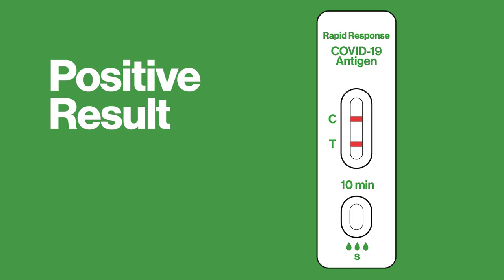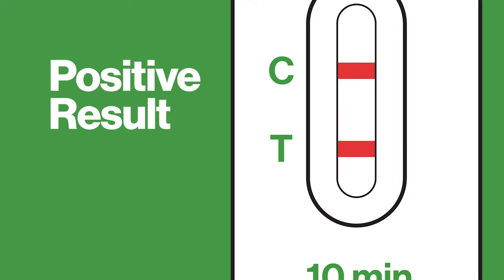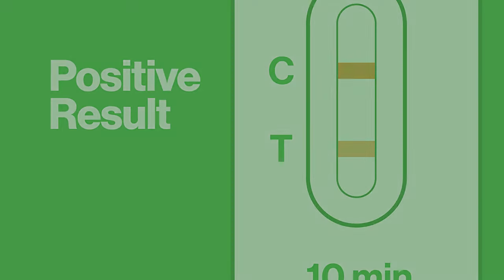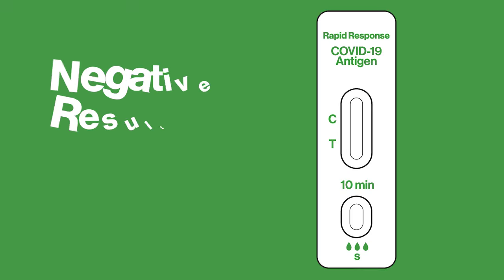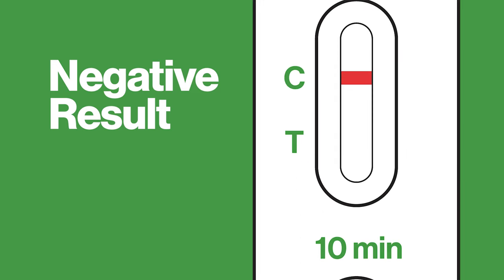The test result is positive if there are two colored lines. One line will appear in the control region C, and another line will appear in the test region T. It's important to look very closely — any line in the test region, no matter how faint, should be considered a positive result. The test result is negative if only one colored line appears in the control region and there is no apparent colored line in the test region.